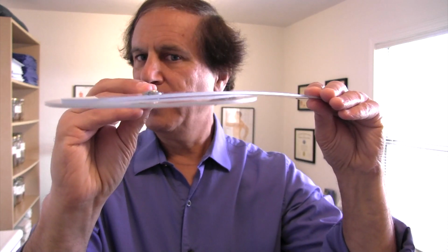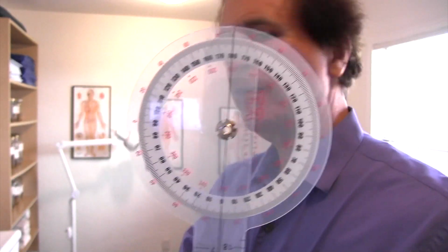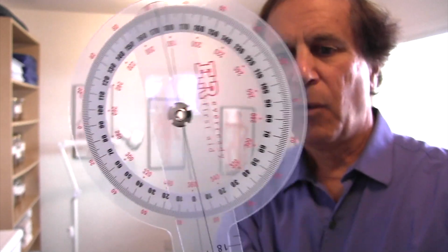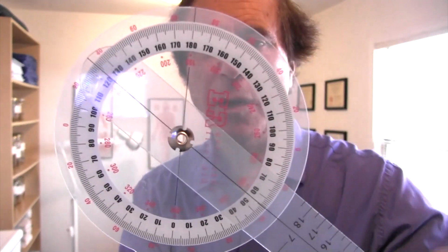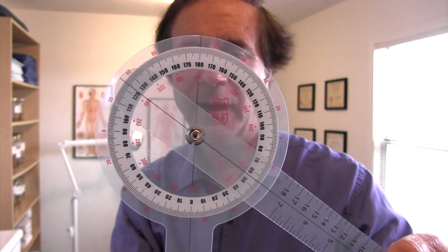So again, if you hold it this way and they're rotating the head, say to the right, you would turn it as the head turns, and to the left, pretty straightforward. This way, as they're facing sideways, you measure how far the head goes forward, or if they extend back, how far the head goes backwards. And you just look at the numbers that it shows on the goniometer, and that's your angle of movement that the patient, client can go through.